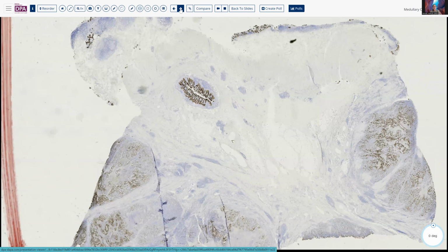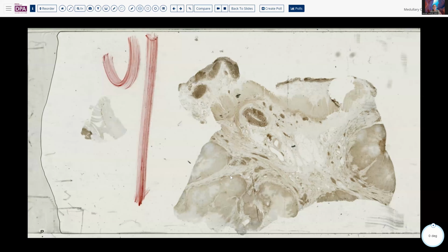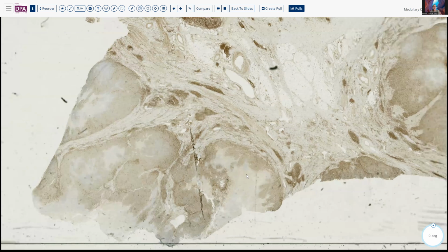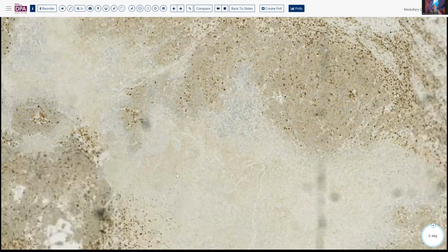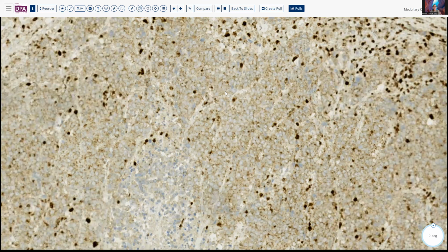The other thing I mentioned, of course, here was the infiltrating lymphocytes, and so when we get down to doing MSI or mismatch repair testing, we discover a picture that looks like this. So here's the stain for PMS2. And very characteristically, all of these tumor-infiltrating lymphocytes are nicely positive, but here you see the tumor cells are these little nuclear ghosts, with a little pale granular cytoplasmic staining that is indicative of non-reactivity. And so many of these tumors, if not most of them, are mismatch repair deficient, usually for MLH1 and PMS2.